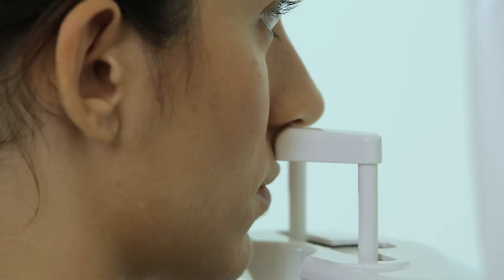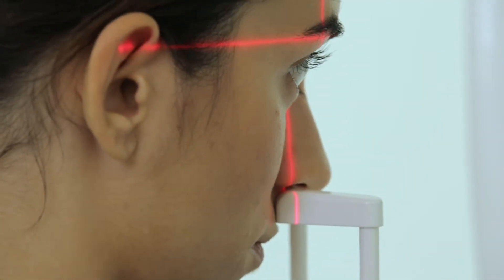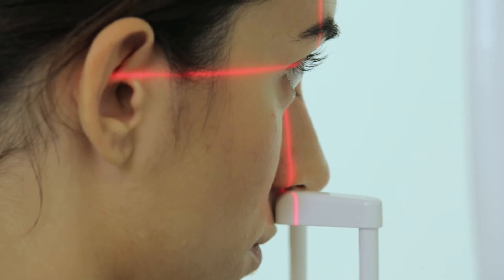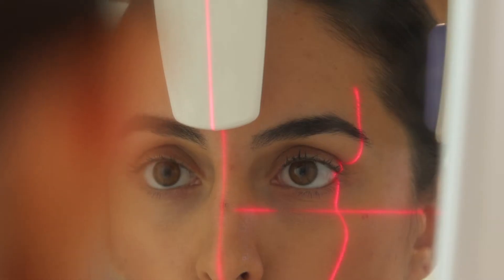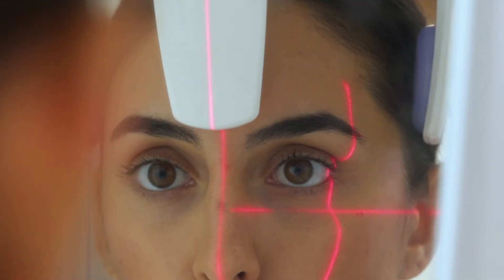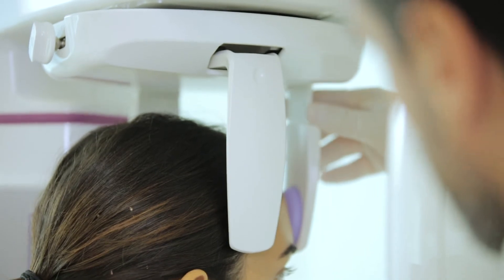The patient can tilt her head slightly forward to facilitate mouth opening, if required. Once the correct orientation has been found, the dentist positions and adjusts the top ends of the stabilizing fins of the head support.